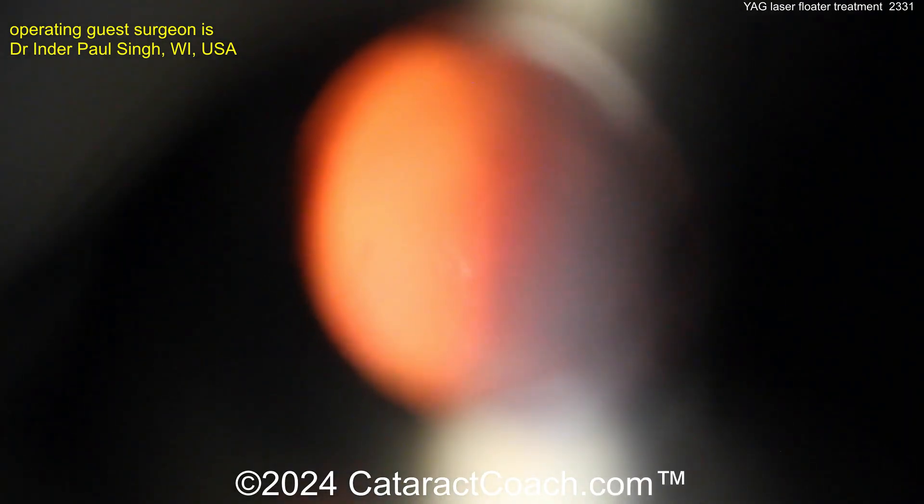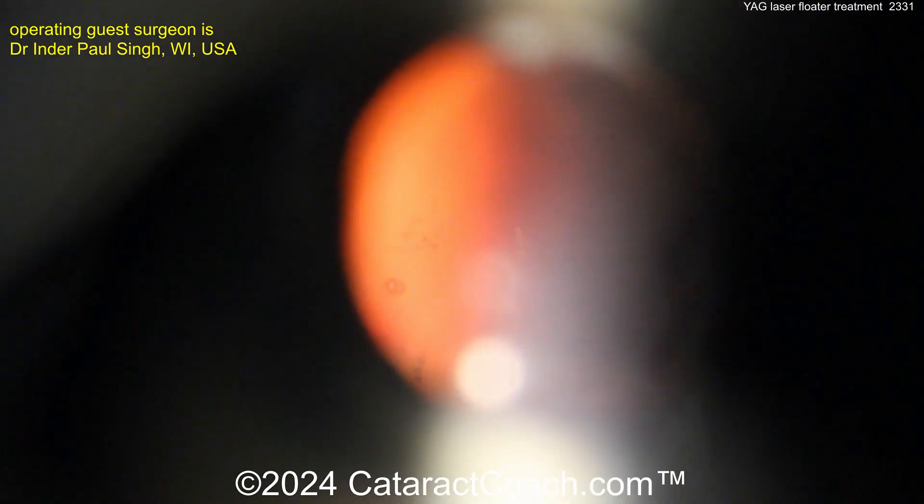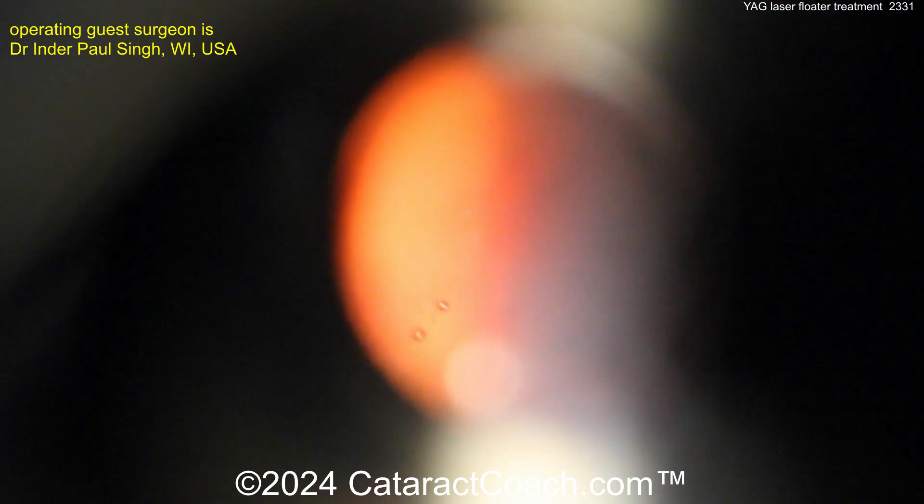See how the floater is not jumping far away? That's important — that's very important. That's the efficiency of the laser. Because of the energy beam — it's a very truncated beam — what that allows is a very efficient energy source, not a lot of scattering or dissipation of energy, which is why the floater stays close by where you are. You don't want it jumping around everywhere. See how it's gone? Pretty much — it's awesome.